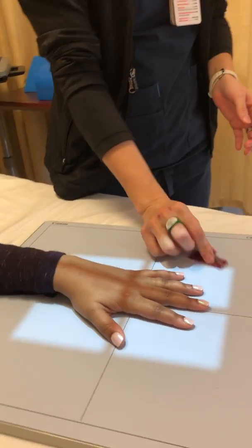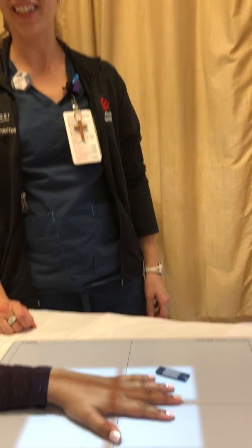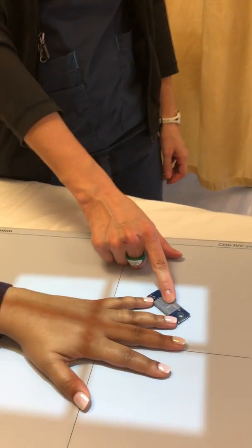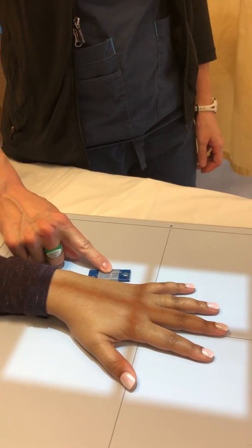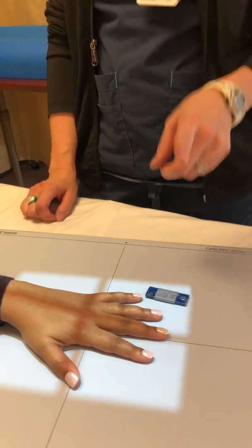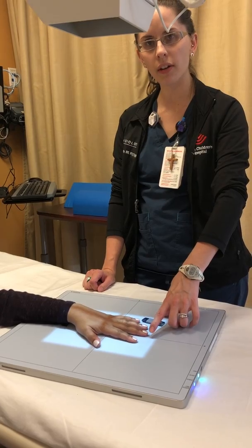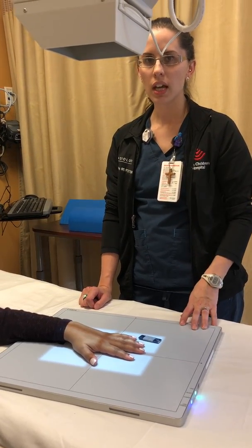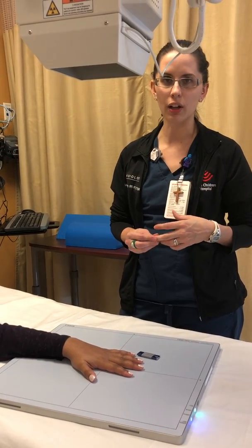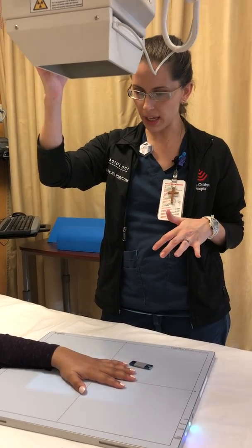Right up there. Oh, it is left. See? Even x-ray techs mark correctly. There you go. So left x-ray, make sure the marker is not too close to your patient's anatomy. Put it here, you can put it here. It doesn't matter as long as it's not tucked up under the patient's anatomy. Another caveat is a lot of patients have rhinestones and decorations on their nails. Please make a note of that in the notes so we can be aware that they were unable to take them off because they're adhered to the nail, or unwilling. So very important. So that's your PA hand.